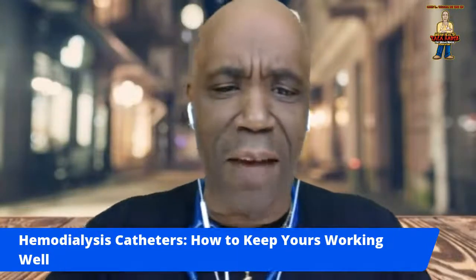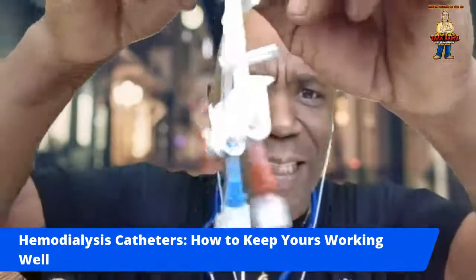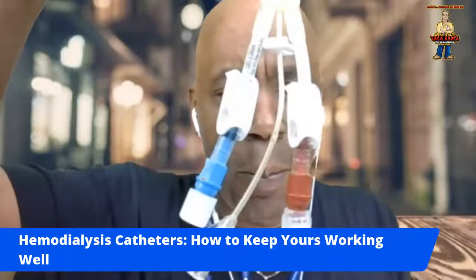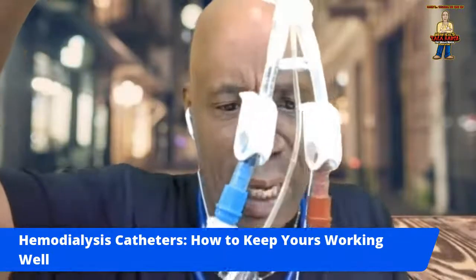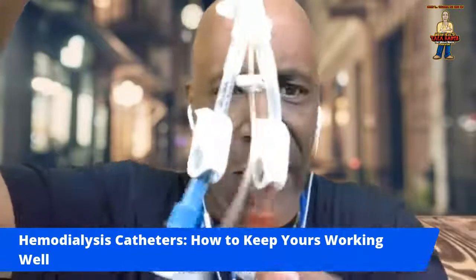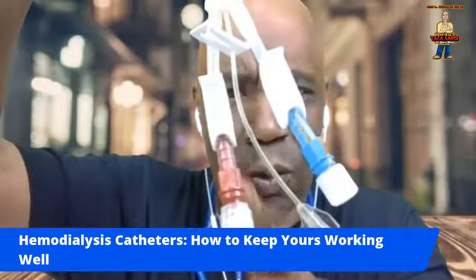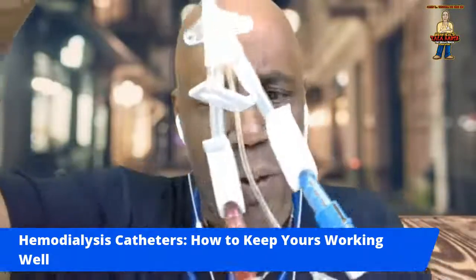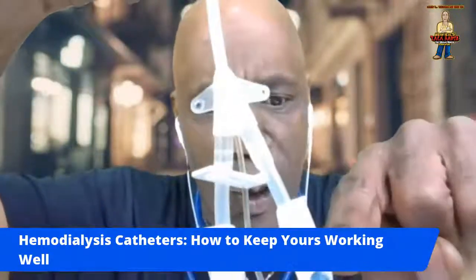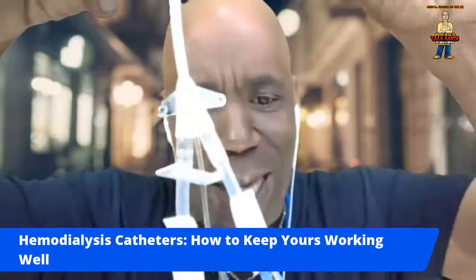Now, catheters have two openings, and y'all seen these, they're very distinct. One is the red, right? And that's to draw the blood out. This one right here, the red. We aspirate, blood comes out. Then you have the blue from your vein where it goes back in.